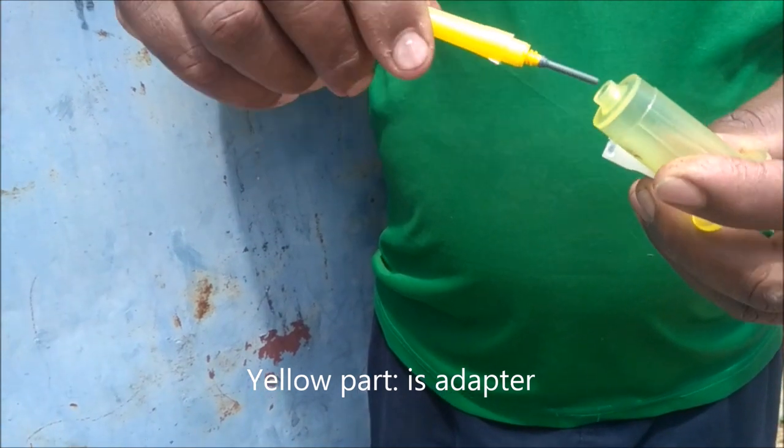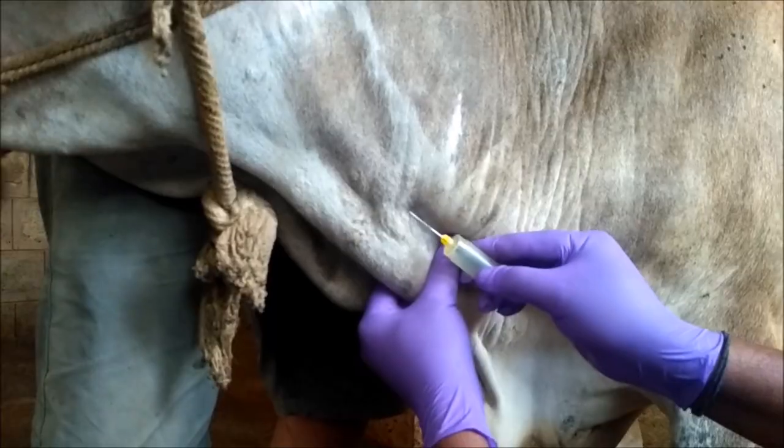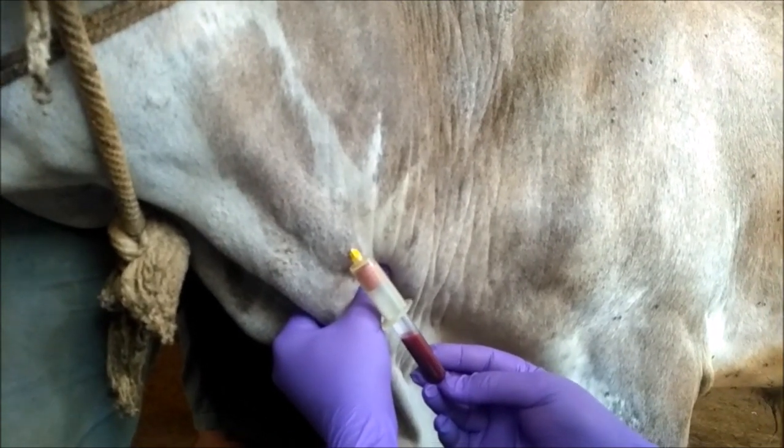Now take the vacuum tube needle and fix it in the adapter. Once you fix it in the adapter, try to puncture the jugular vein. Then take the vacuum tube and press it into the adapter.